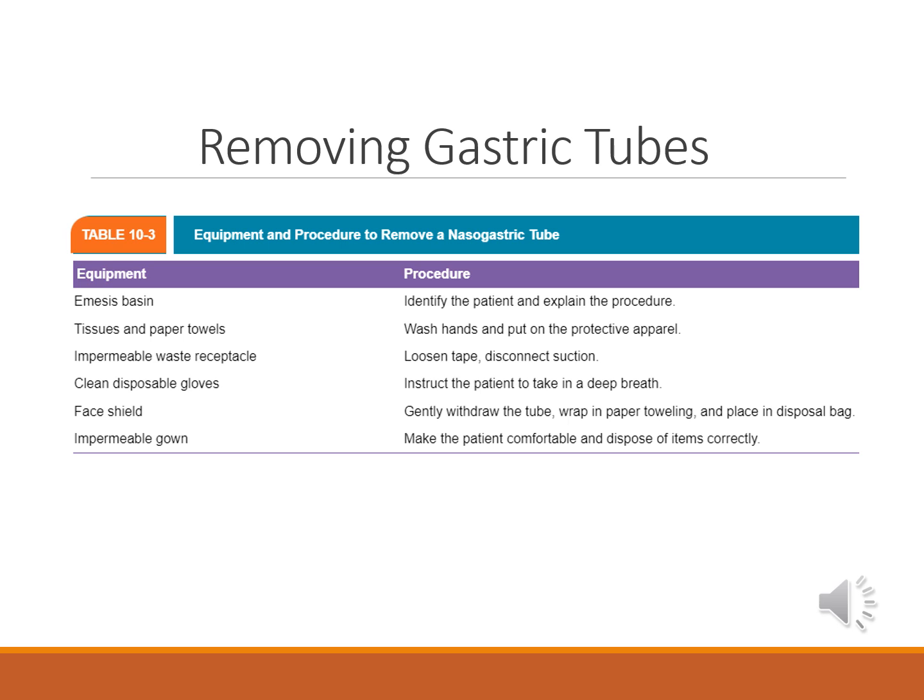They may either be removed through the intestinal tract or by pulling them out rectally. While technologists are not responsible for removing NG or NE tubes, they should always be aware of the necessary equipment and procedures in case they need to assist with the process.